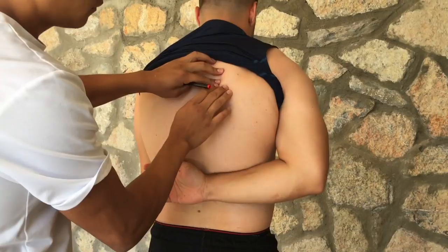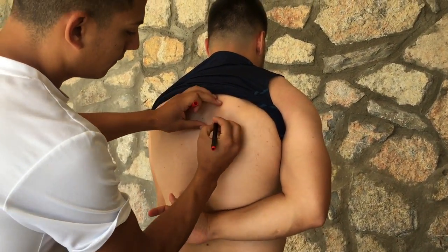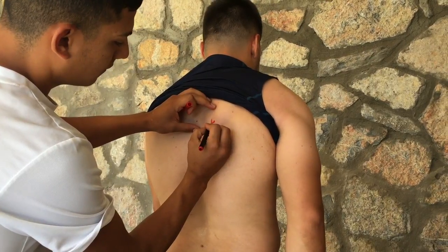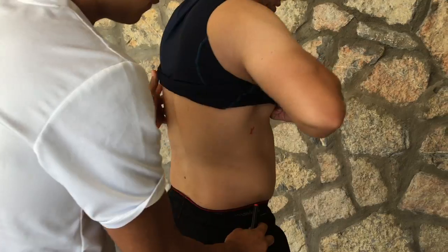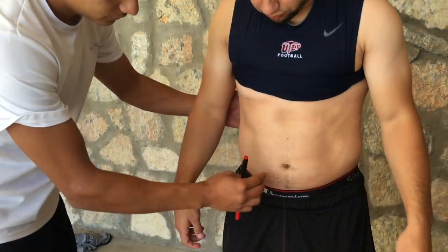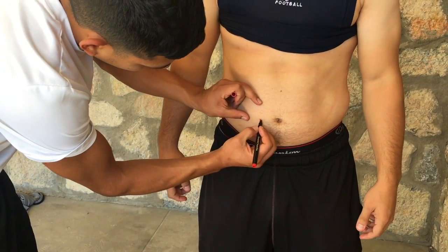For the subscapular site, you can have your client place their arm behind to locate the scapula. Make sure you place the arm back to the side of the body when measuring. This is 1 to 2 centimeters below the inferior angle of the scapula. The abdominal site is 2 centimeters to the right side of the umbilicus.